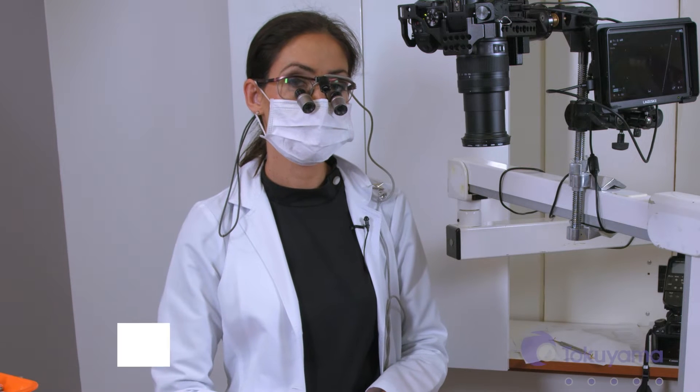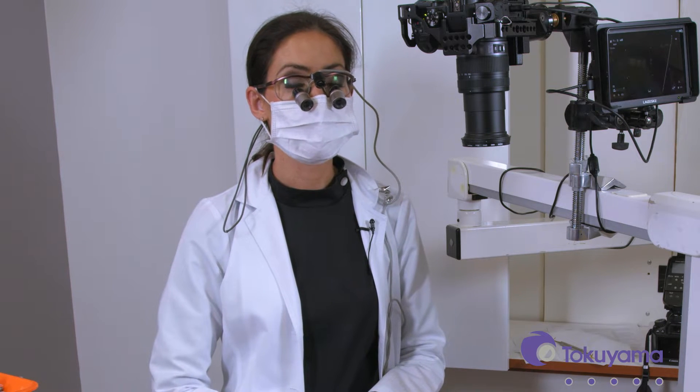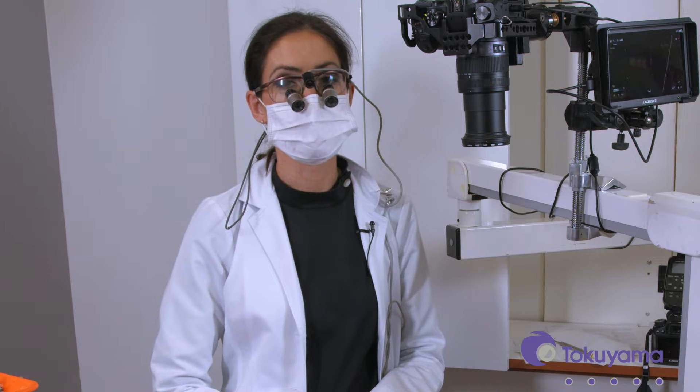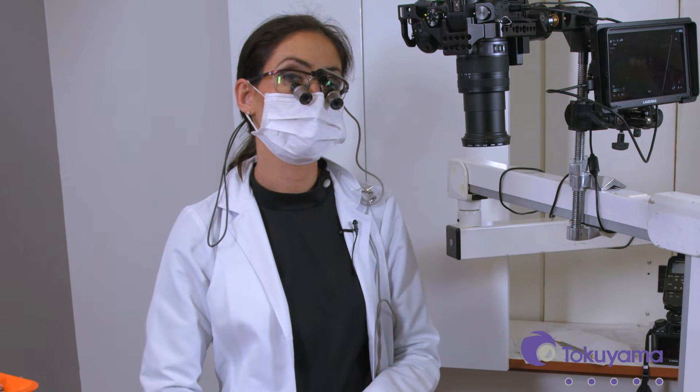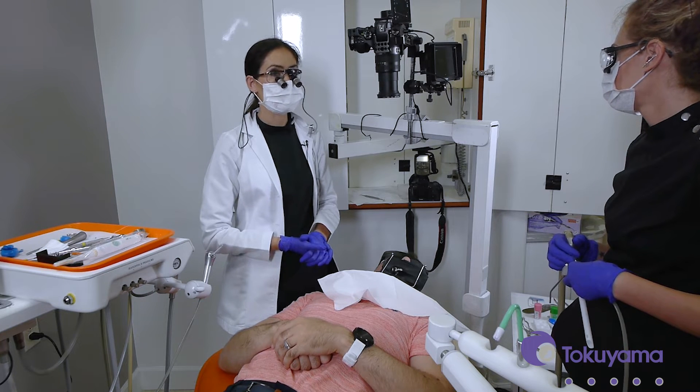So for this next procedure, we'll be treating tooth number seven. The patient already has a mesiofacial filling, but since he whitened his teeth, the tooth has now become lighter than the restoration and it's visible. So we're going to be replacing that with Omni-Chroma. If he changes the shade of his teeth again, that will continue to blend in with the tooth.